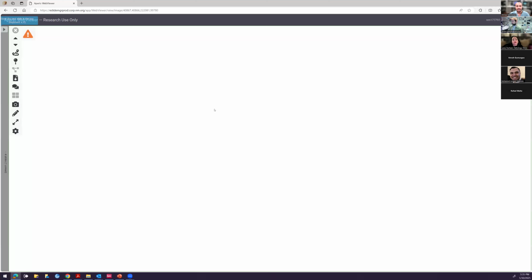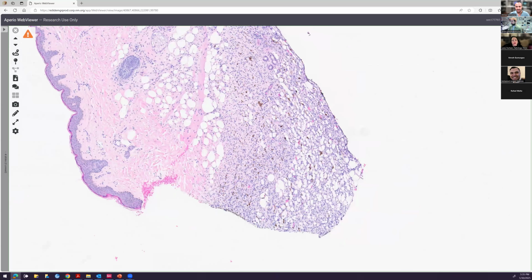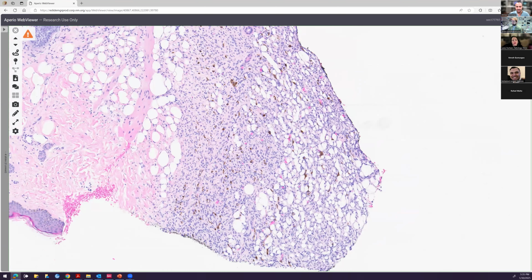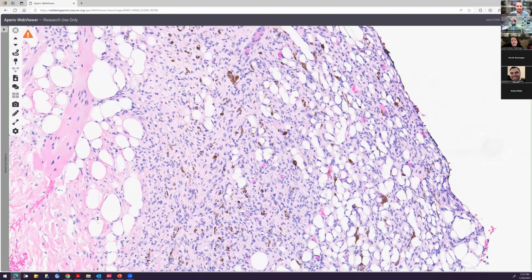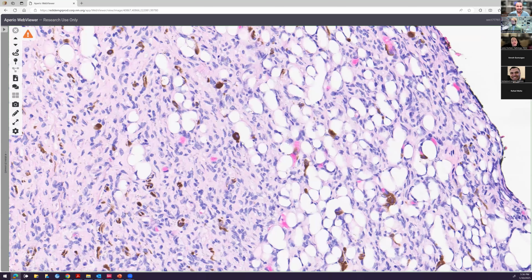Cool. And I think this last one is one final variant. What is going on here? What's this stuff? See, of course, it's quite infiltrative still. It's like a skin biopsy, but what is this stuff? Hemosiderin? Not quite. No. Could be a thought. What else?